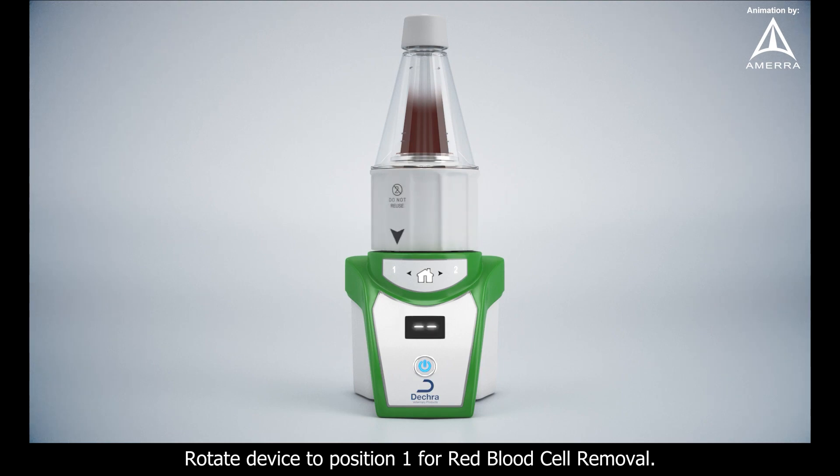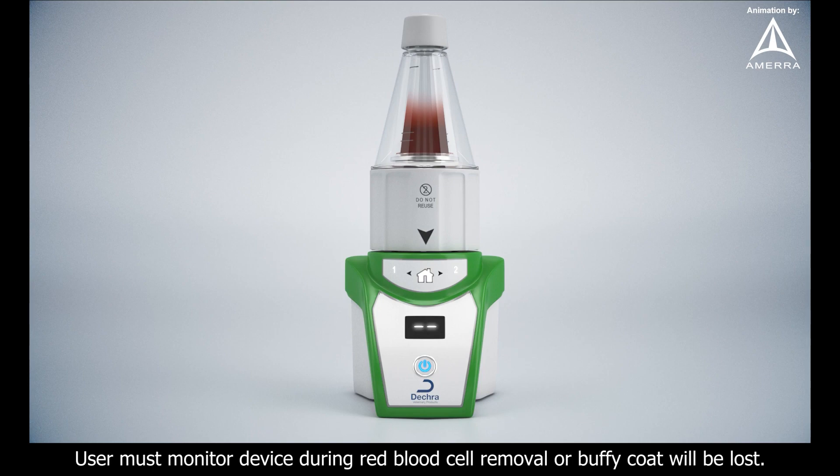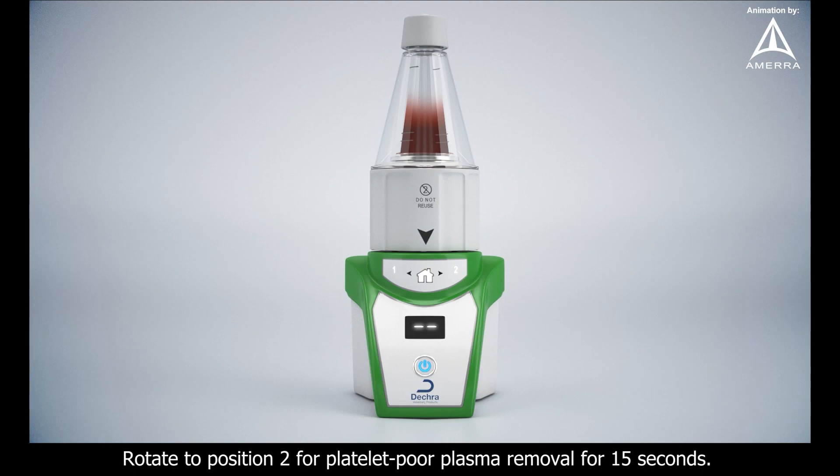Rotate device to position 1 for red blood cell removal. When the buffy coat is between the two horizontal stop lines, move back to the home position to stop the process. User must monitor device during red blood cell removal or buffy coat will be lost.